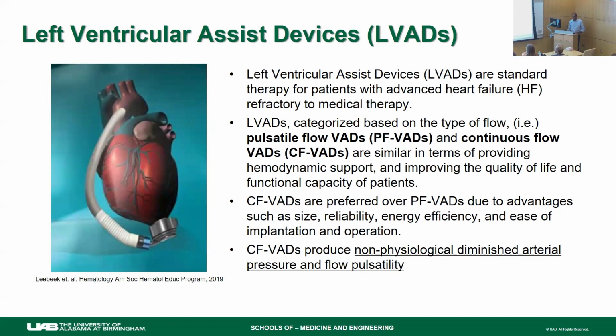So for the continuous flow VADs, there was a huge debate initially, but then I think the community settled on continuous flow VADs, and almost all the VADs put in patients past 2000 are continuous flow VADs. They have several advantages that are listed there, but the key thing I want to point out is that when you get a continuous flow VAD, you go from this normal pulsatile flow that you see in normal arteries to this non-physiological flow, which is not completely continuous, but continuous for the most part.